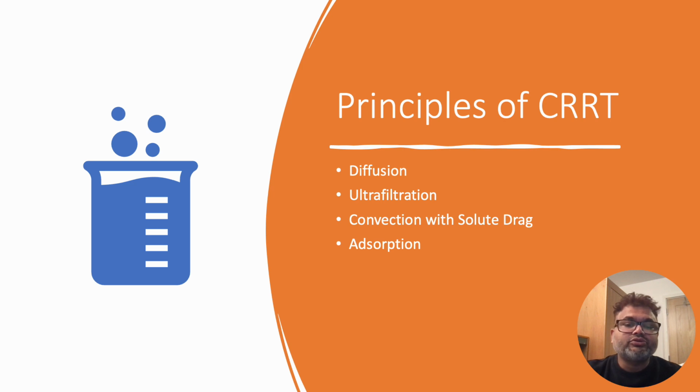To understand the mechanism through which those machines work, we have to understand four main principles, and those are diffusion, ultrafiltration, convection and solute drag, and adsorption.